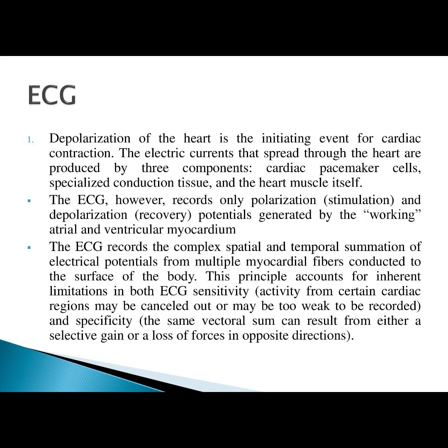The ECG records the complex spatial and temporal summation of electrical potential from multiple myocardial fibers conducted to the surface of the body.